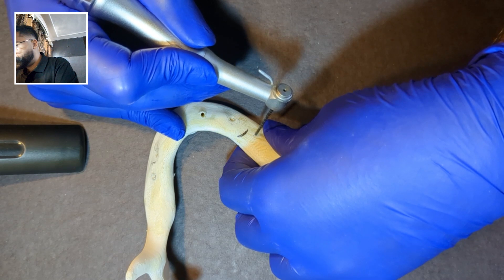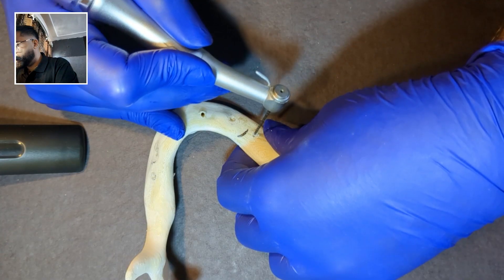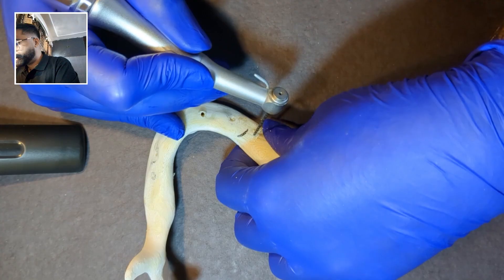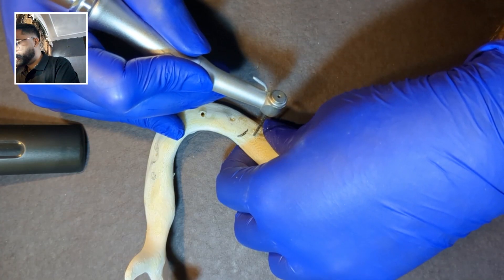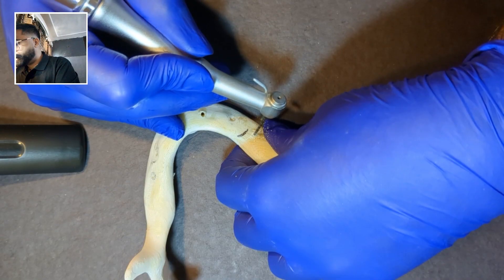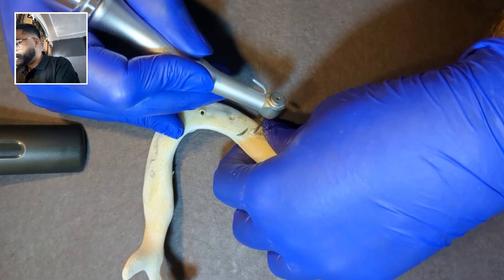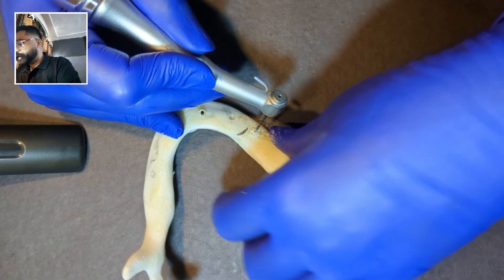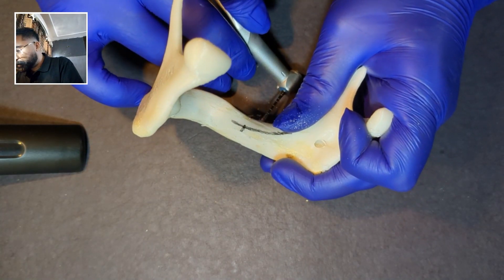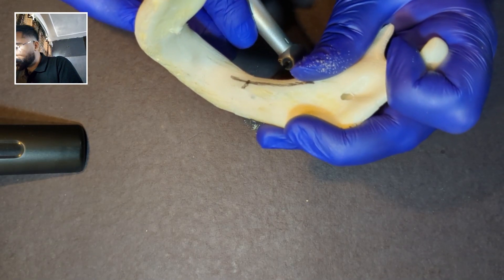I am drilling the first cortex now — the first cortex is drilled. Now the bone becomes soft and I am entering the cancellous bone. Now I am able to feel the second cortex. I will stop my drill just when I feel the tip of my drill touching my finger. The tip of the drill — I am able to feel the tip of the drill.